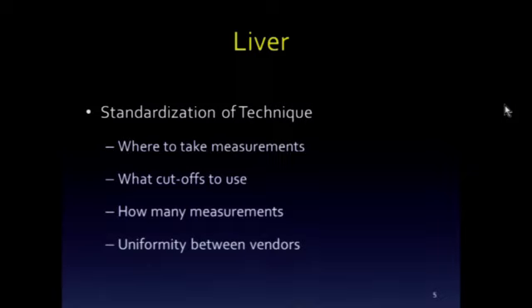And in MR elastography, all of the vendors use the same technology, the same equipment, the same pulse sequences, and there's very little variability, if any, between the results depending on which vendor you have. Unfortunately, in our ultrasound techniques, that's not exactly the case, and the QIBA committee from RSNA is working on trying to get vendors to move together and try to get more accurate results as well as more consistency between vendors. And we'll talk about that as we move through the talk.